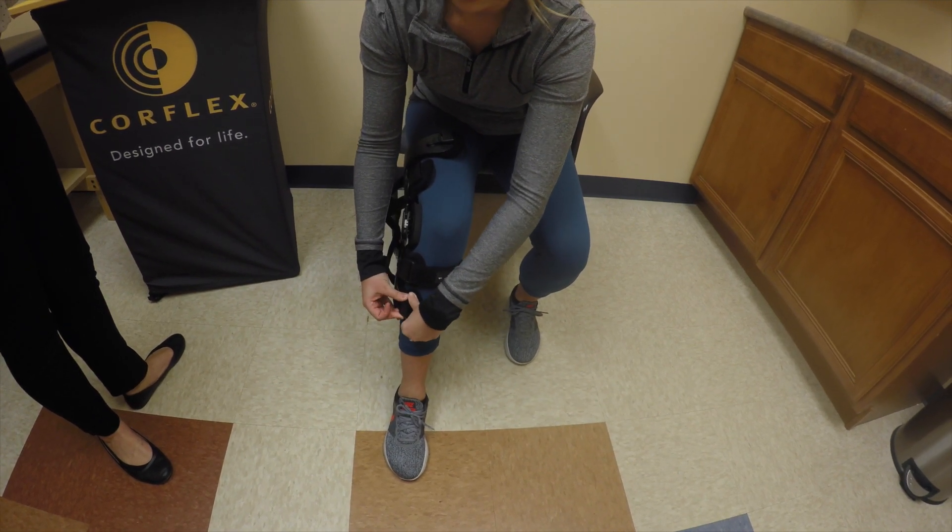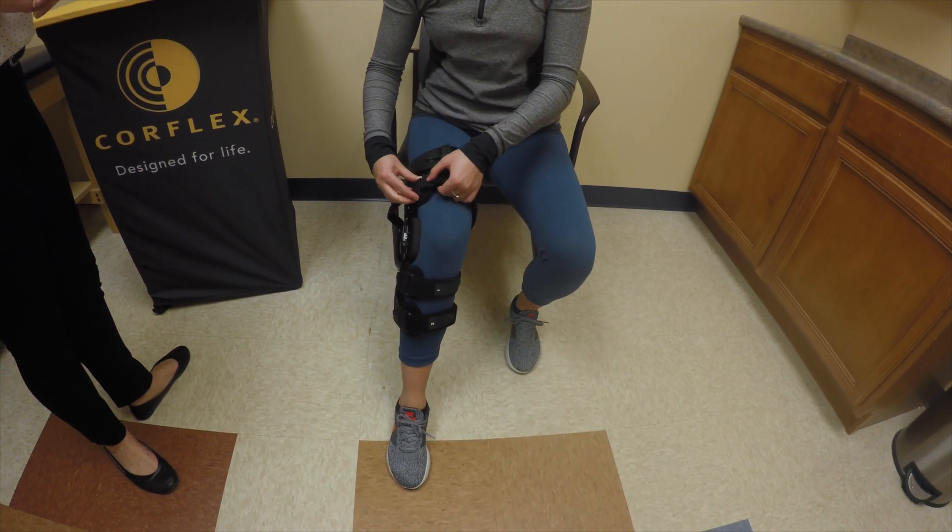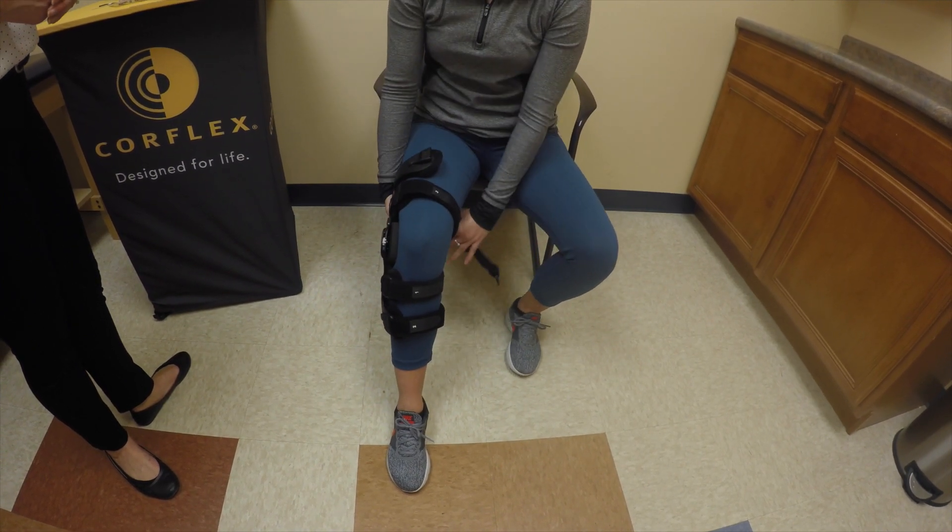Strap number two is below strap number one. You'll do strap number three right above the knee. And then strap four is all the way at the top.